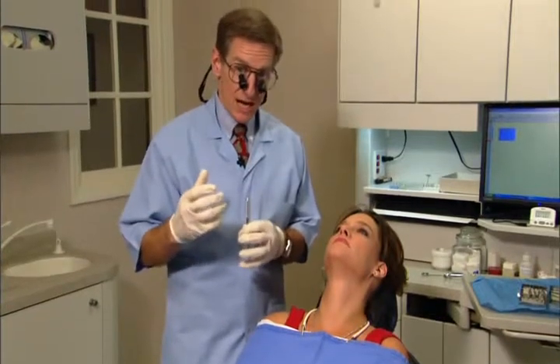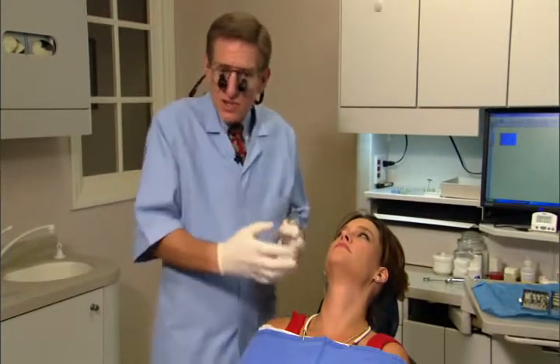Every once in a while you'll find a patient with big exostoses lateral to the molars. You'll really bang into those with a tray, but if you know they're there you can work around them — you may need to go to a larger tray. This oral exam takes about 20 seconds. Step two is to try in the trays. You can get a good idea about arch size and shape from this exam.